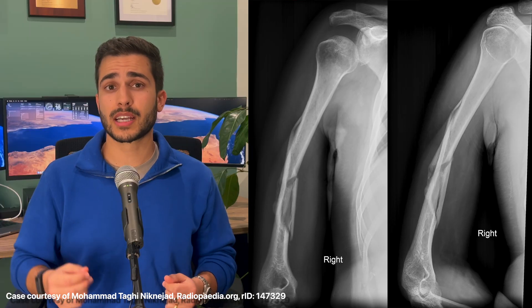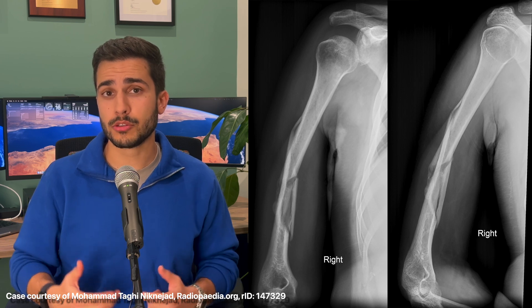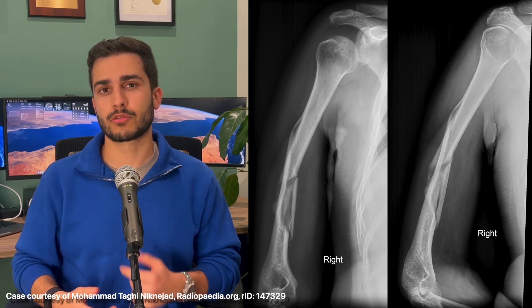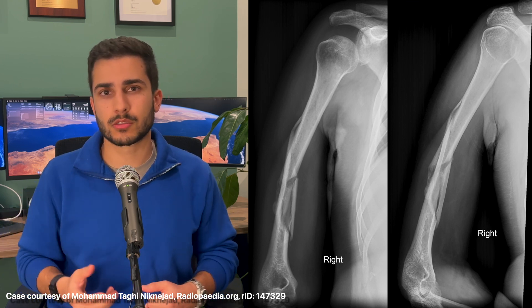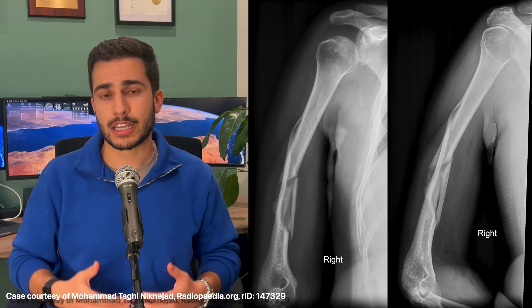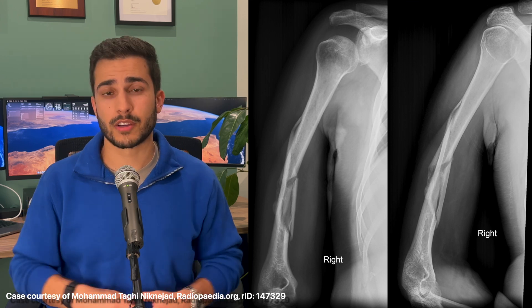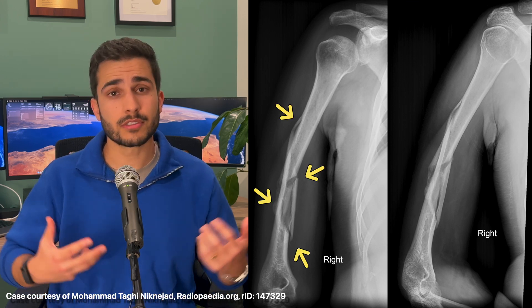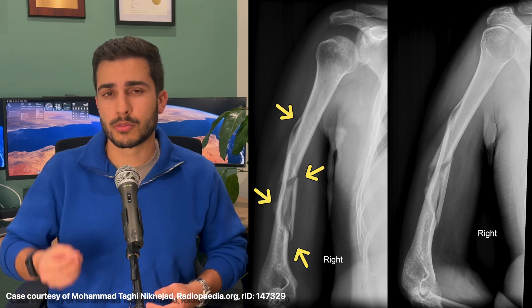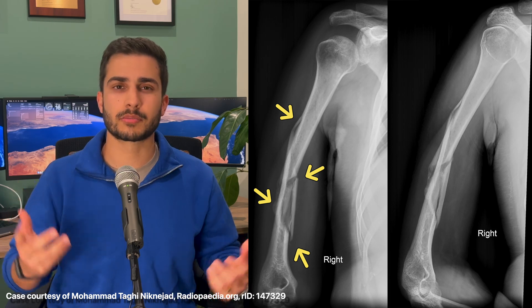Here's another example of a comminuted fracture, again of the humerus, this time on the right side. The patient presented with trauma, and you can see the trauma was quite severe. There are multiple bone fragments along the shaft of the humerus, with most of the bone fragments being mildly displaced.